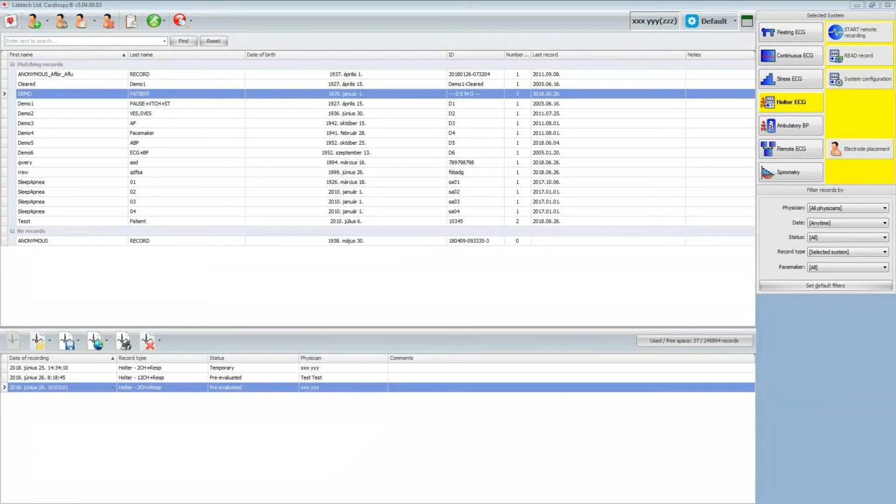It is also important that this data protection key is only used for the Holters, the ABP and the combined devices, because these are our only devices that store patient information.